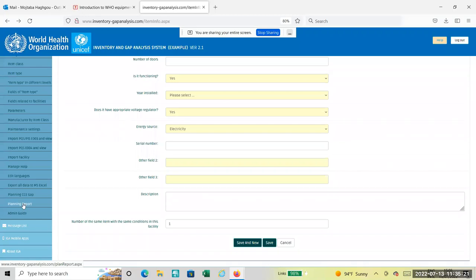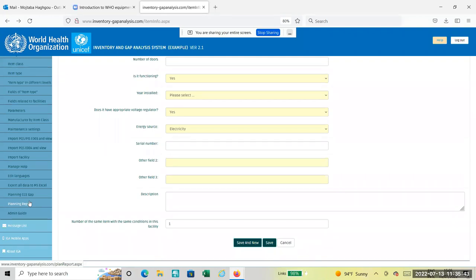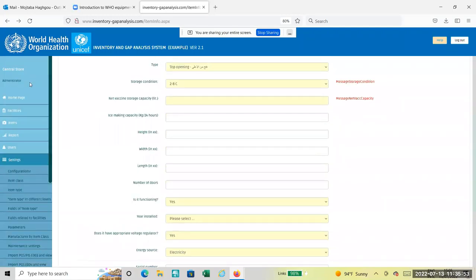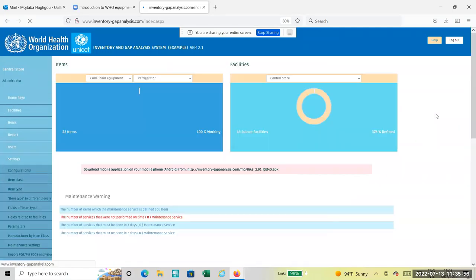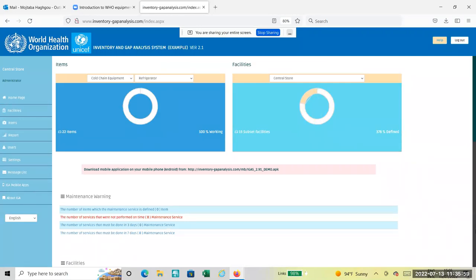There is also a planning function. Once you have the gap, the same as the sizing tool, you can select the right equipment for that gap. Data entry and a few reports also exist on the mobile application - everything mentioned can be done on mobile, and the mobile application can be downloaded to your phone.